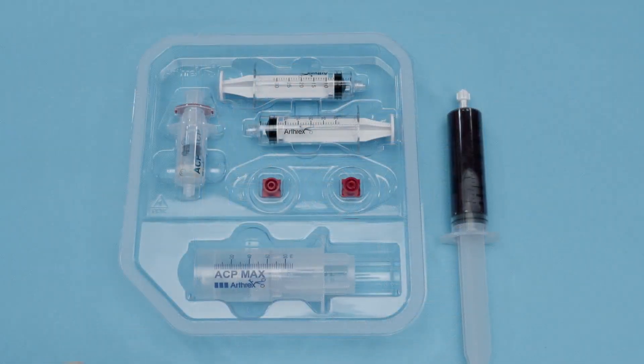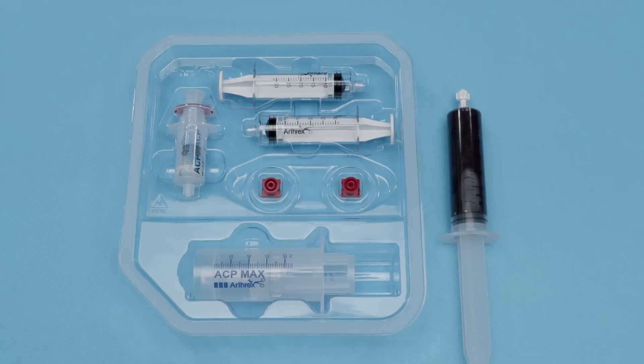Once you have your peripheral blood drawn, before you draw the peripheral blood, you're going to want to put four cc's of ACDA for every 30 cc's of peripheral blood you plan to draw. If you're using a 30 cc syringe, you draw up four cc's of ACDA. If you're using a larger syringe, such as a 60 cc syringe, you're going to want to draw eight cc's of ACDA prior to your peripheral blood draw.